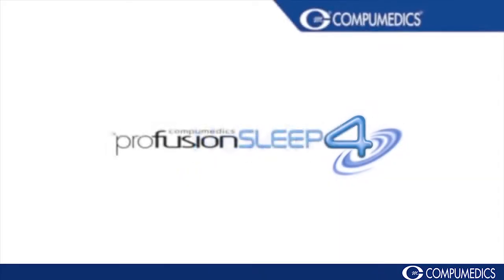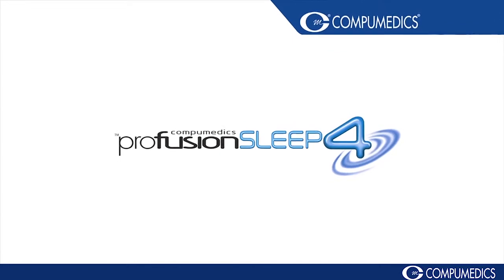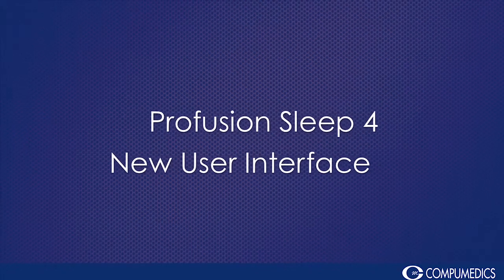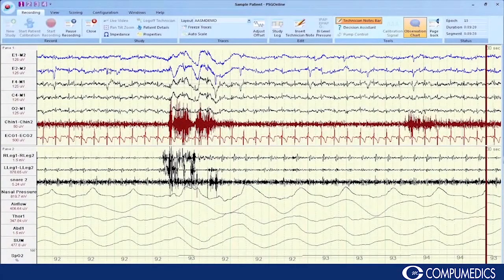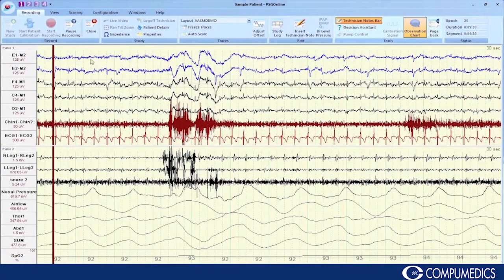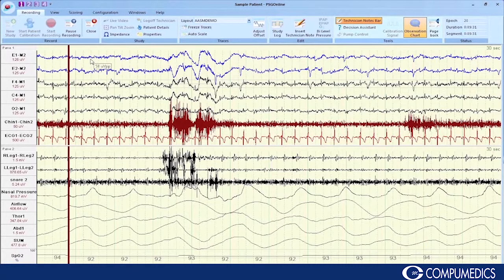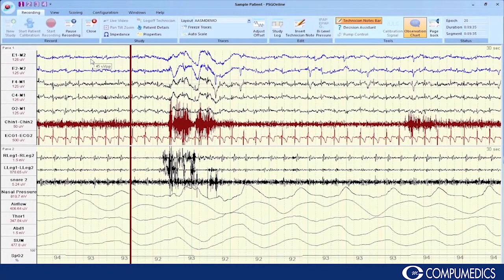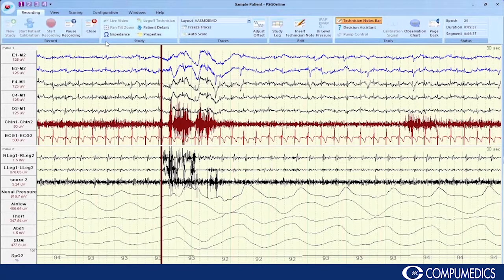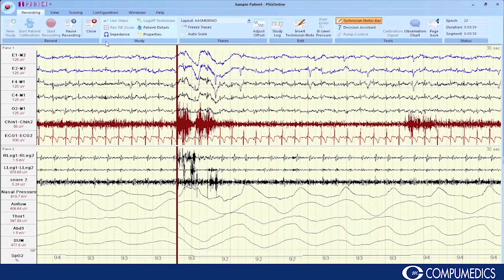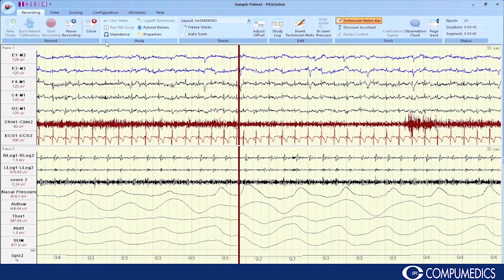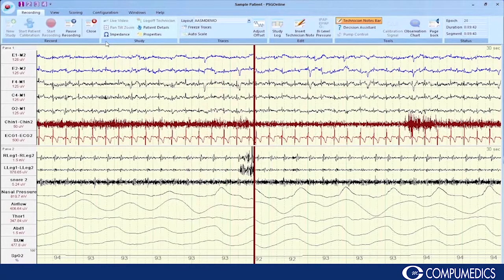New in CompuMedics ProfusionSleep 4. ProfusionSleep 4 provides a totally new user interface. Sleep 4 incorporates the modern intuitive ribbon bar technology, which replaces the drop-down menus and organises tasks into easy to find, workflow-oriented tabs.